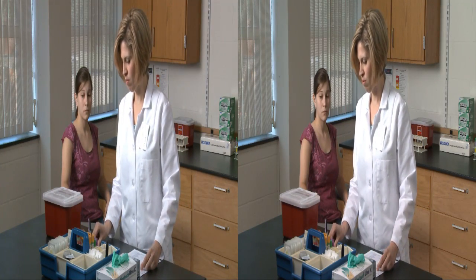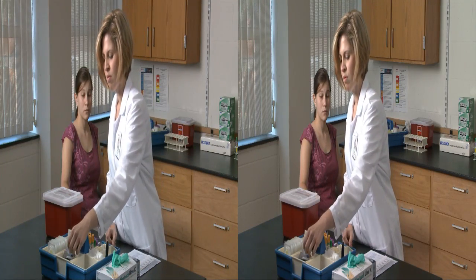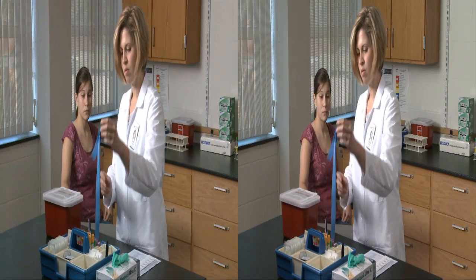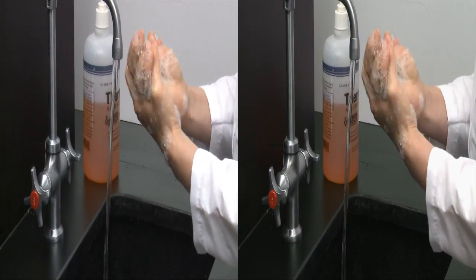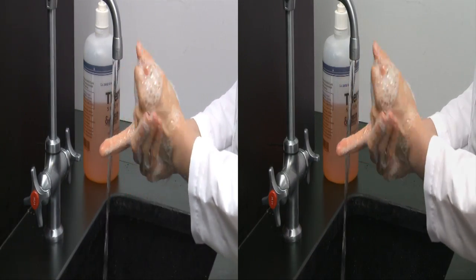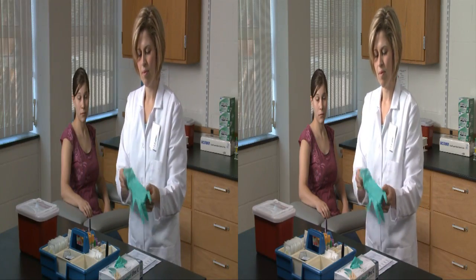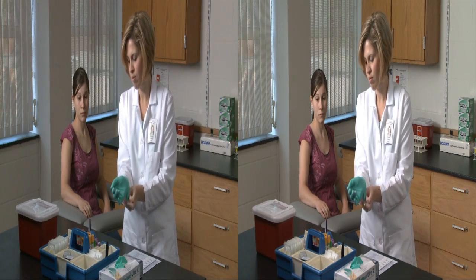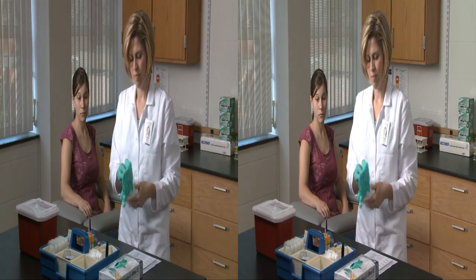Address any inconsistency first with a requesting physician or health care worker on duty. But if the given information does agree, it's time to prepare yourself and the patient for a successful blood draw using proper standard precautions. The phlebotomist washes and then dons a clean pair of gloves before proceeding. Make sure alcohol prep pads, gauze, tape, the correct gauge needles, and required evacuated collection tubes are within easy reach for you, but out of the reach of the patient.